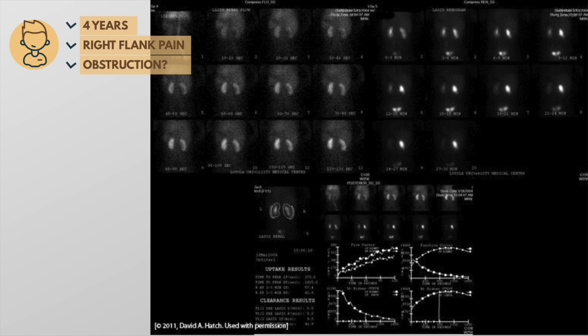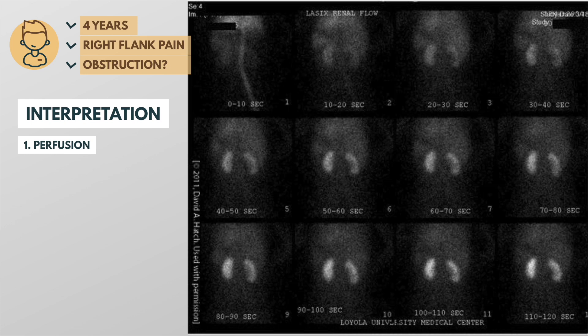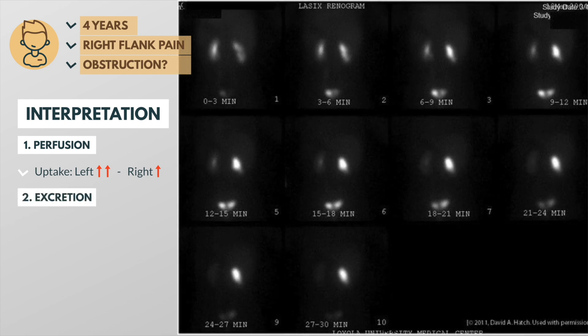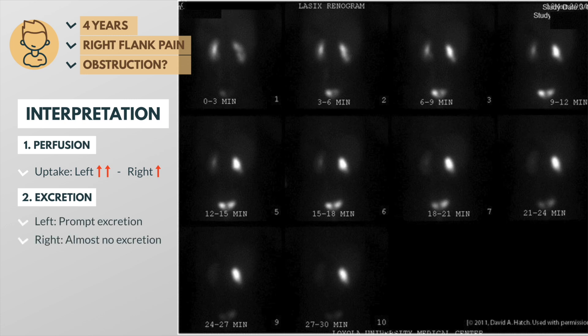Notice that the images on the perfusion panel are a bit fuzzier than those on the excretion panel, and the time intervals are in seconds rather than minutes. Both kidneys show uptake, but the right kidney doesn't get quite as bright. When looking at the excretion panel, the left kidney shows prompt excretion, but the right kidney retains the radioactive tracer even in the last image.